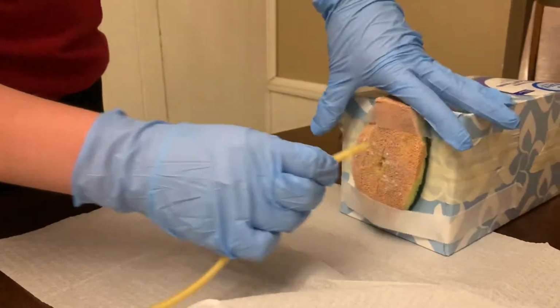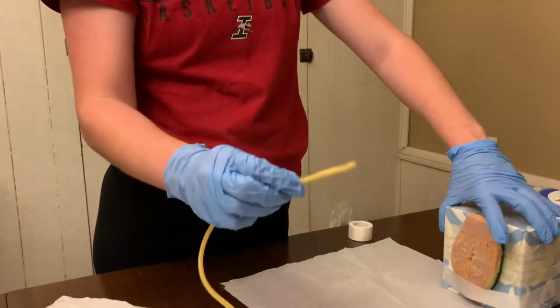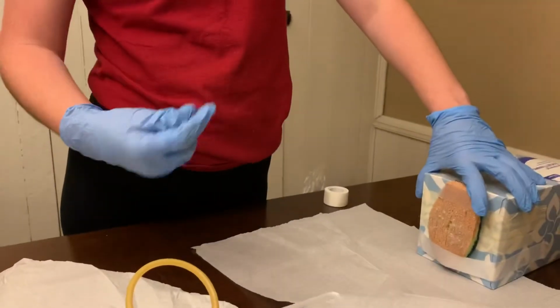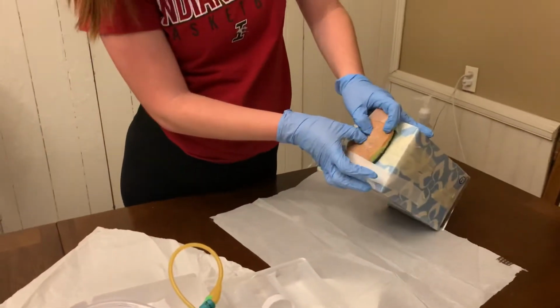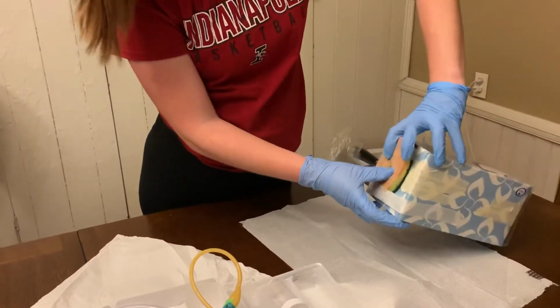Okay, so I'm going to pause for a second, and I'm going to put this back into my sterile container. In the clinical setting, obviously, I would have to start over with a new catheter. I just have to realign. For some reason, my sponge isn't lining up with the hole.